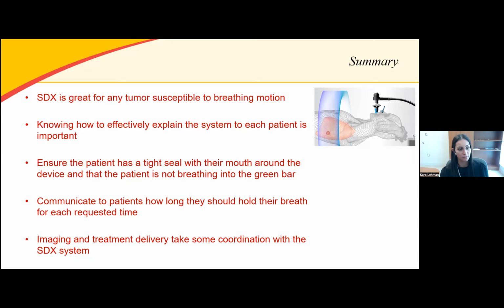And then just be sure you communicate to patients how long they need to hold their breath for each requested time. That makes sure that you don't need to repeat any imaging. For example, if they don't know that you're about to take a cone beam CT and you need them to hold their breath for a long period of time, and they think it's just another X-ray that is only 5 seconds, they might not be ready to hold their breath. So just make sure that you as the therapist are adequately communicating to them how long you want the patient to hold their breath for this particular time.